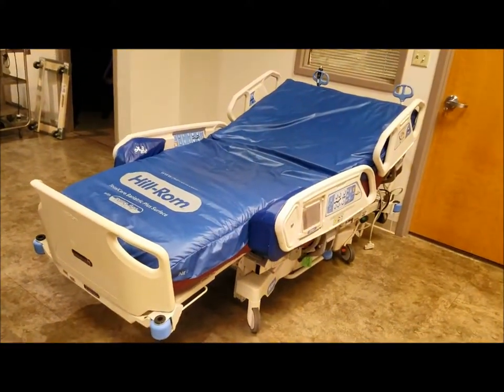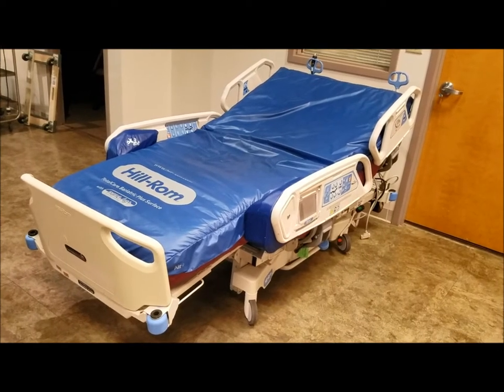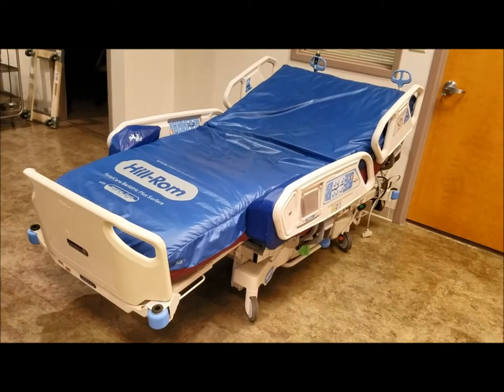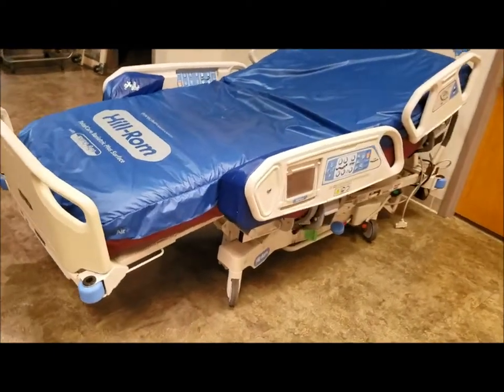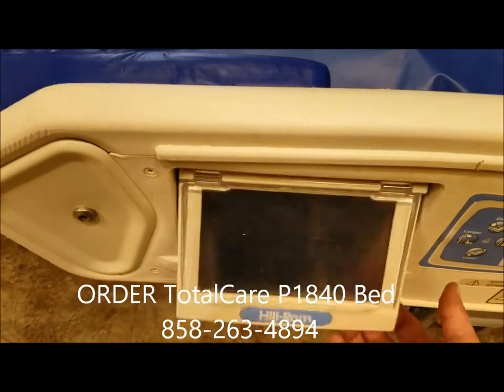Like we said, low air loss. It's going to have an auto patient turning feature. And it also has a feature called percussion, which is going to turn the patient from side to side and then also help knock some of the congestion out of the upper respiratory system.